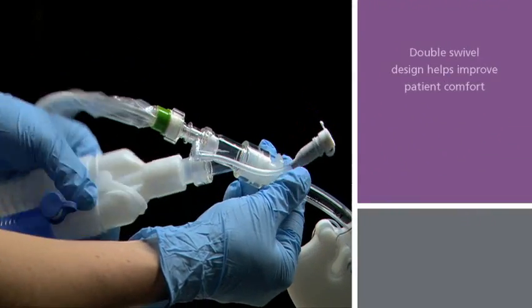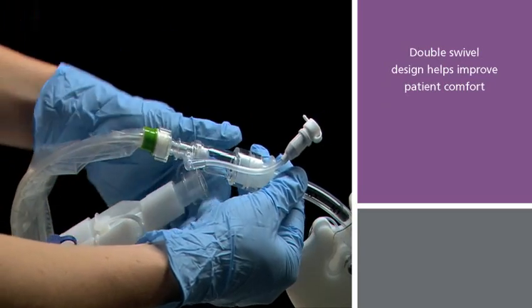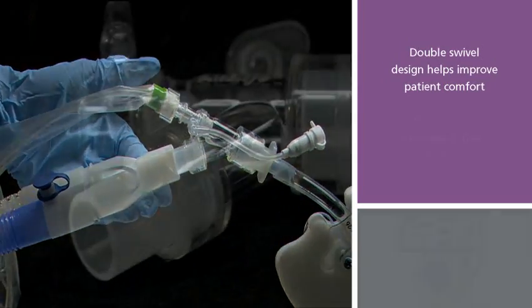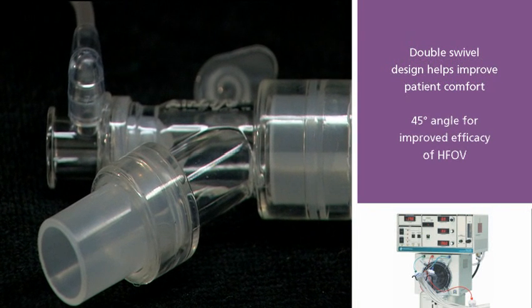The double swivel design of the Verso adapter helps limit torque on the airway for greater patient comfort, while the 45-degree angle reduces flow resistance for improved efficacy of high-frequency oscillator ventilation.